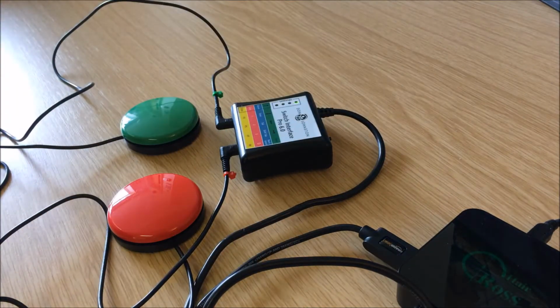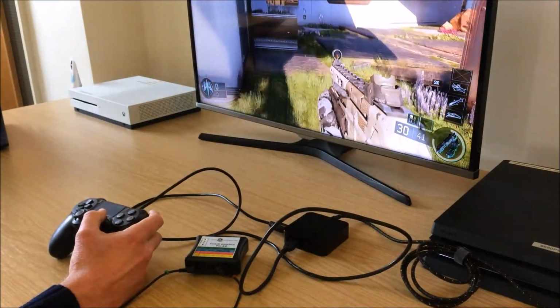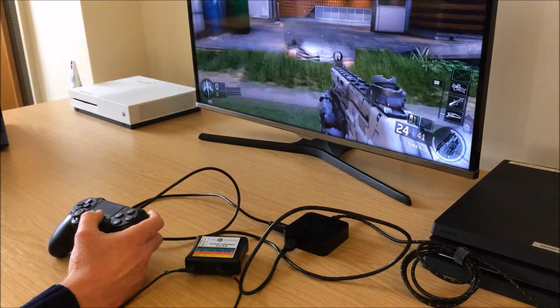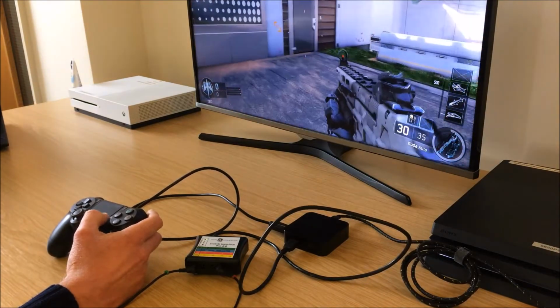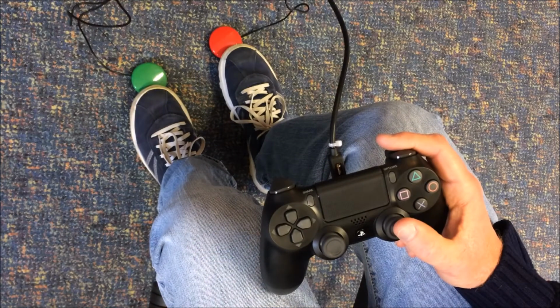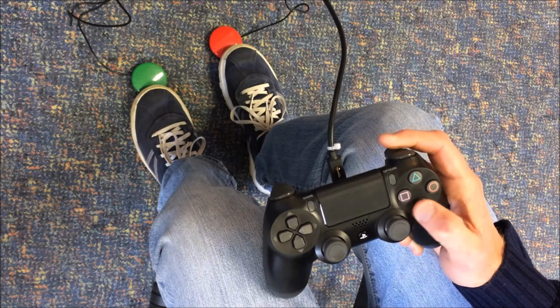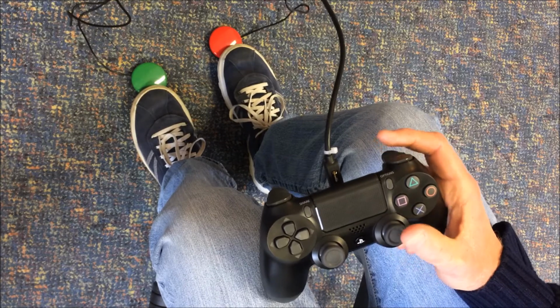You can have the buttons positioned wherever you can press them. Here we will be using a buddy button for walk forwards and another one for aim. We will be using these as foot switches. You need to make sure that any extra buttons are programmed to the same row of buttons on the Don Johnston. Here we are using the right arrow key for L2. You can still use the right analog stick for looking around in game. The green button is acting as walk forwards and the red button is acting as aim.